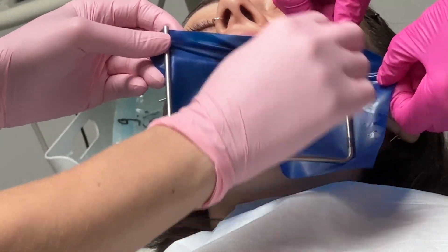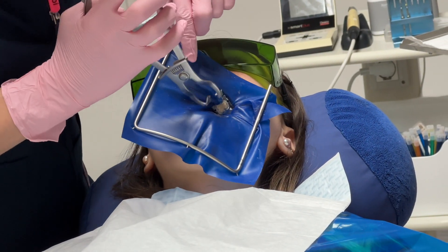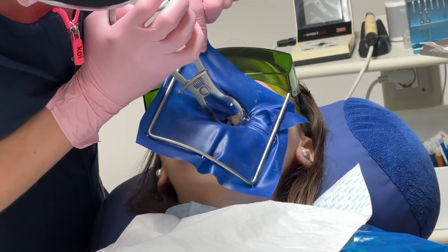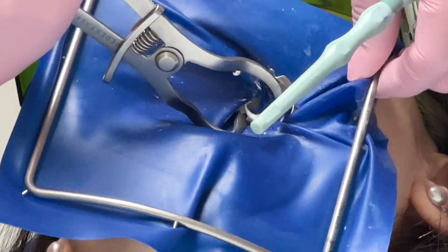There are several treatments where dental dams can be applied: dental restorations, endodontic treatments including root canal therapy, fissure sealants, preparation of dental crowns, dental implants, and some veneer placements too.